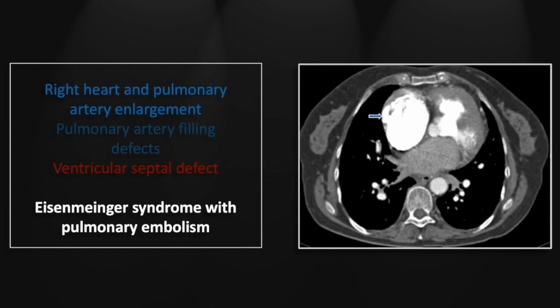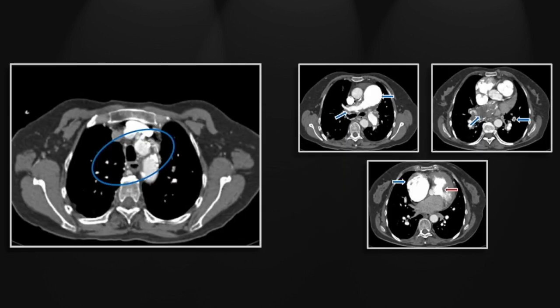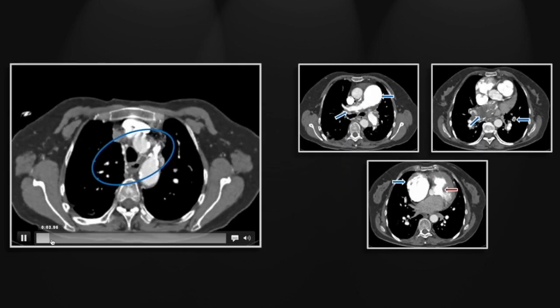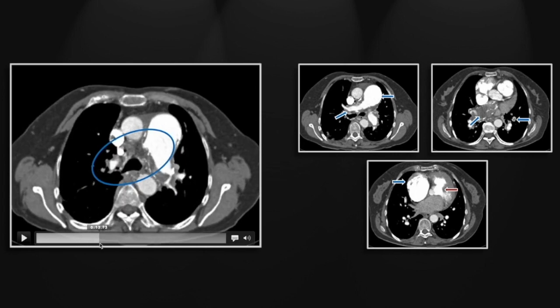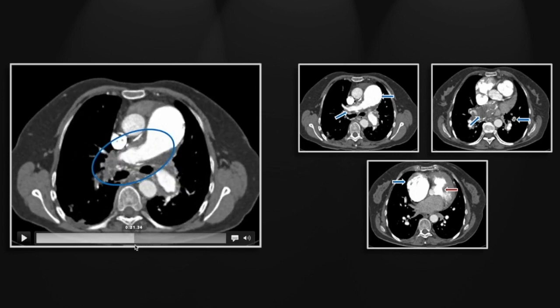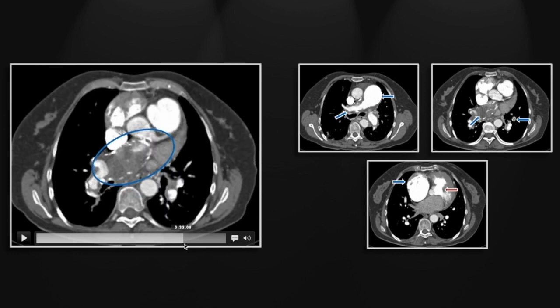Here you see the pronounced enlargement of the right atrium, and the membranous ventricular septal defect with nice demonstration of right-to-left shunting. The left atrium shows no contrast opacification, and the dense contrast of the right ventricle is passing directly into the left ventricle. Appreciate the marked enlargement of the pulmonary arteries and that chronic wall thickening and calcification.